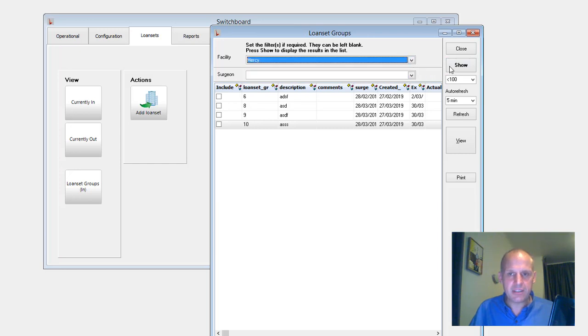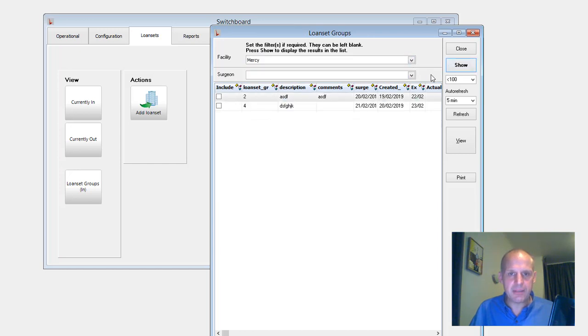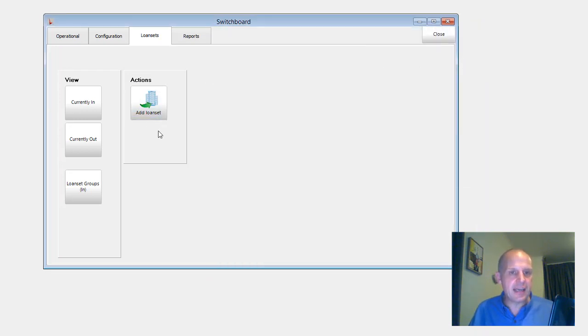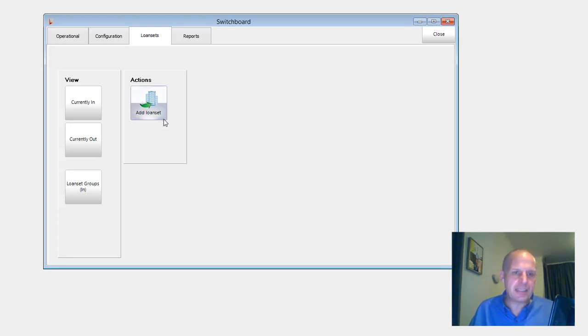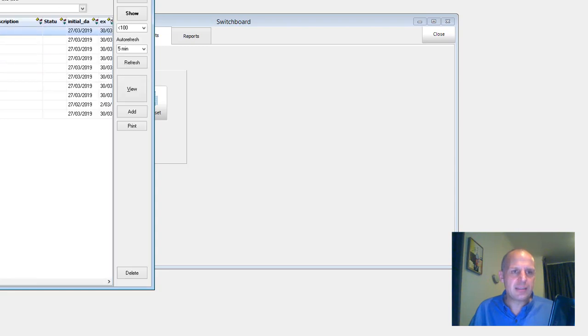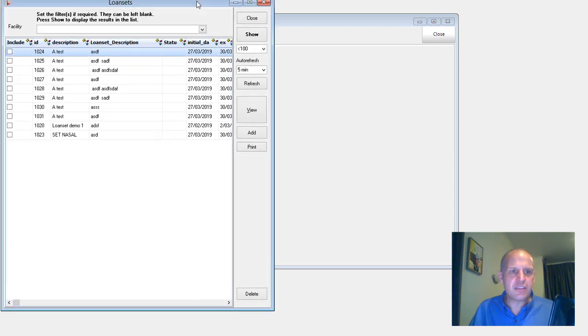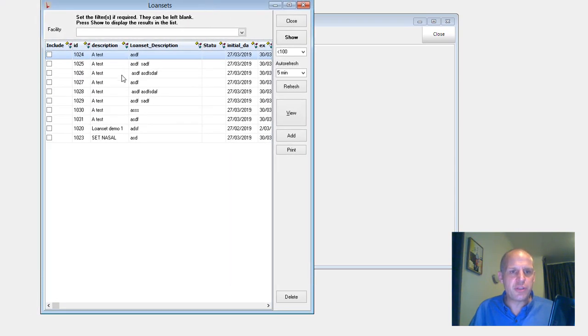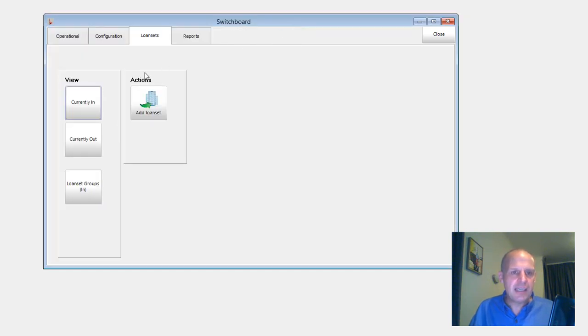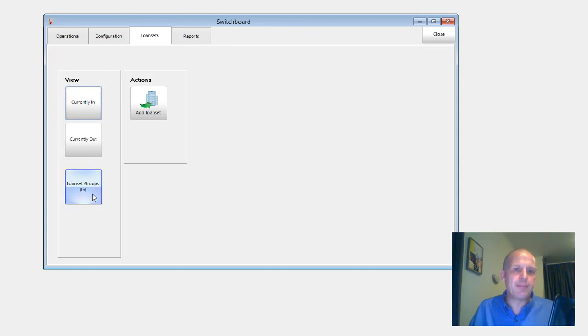And I'm just getting sidetracked in a demo. Never a good idea. So, so loan set functionality has changed to try and once again, just make it simple. And if I click on this one, this is the traditional view that we used to have every single tray individually listed. So now we can either do it individually or as a group. And so that just makes it a lot easier to manage.